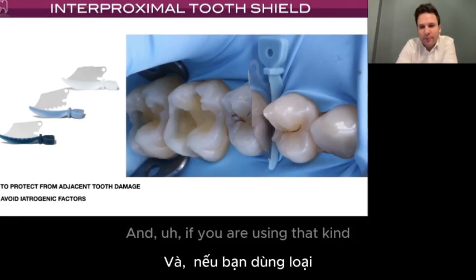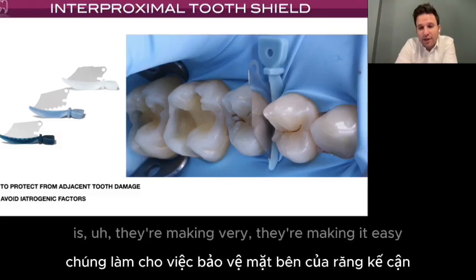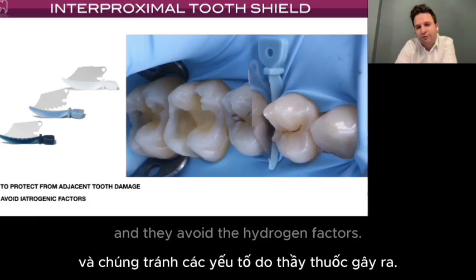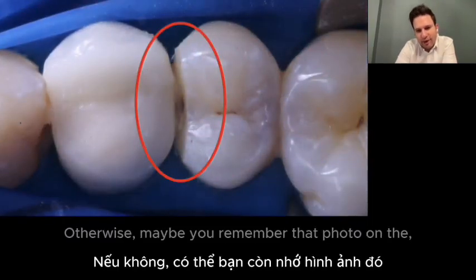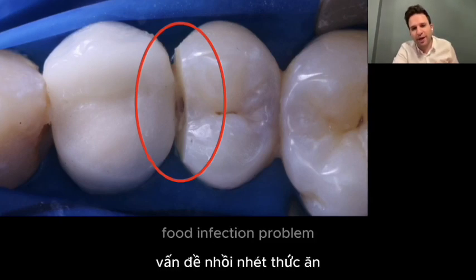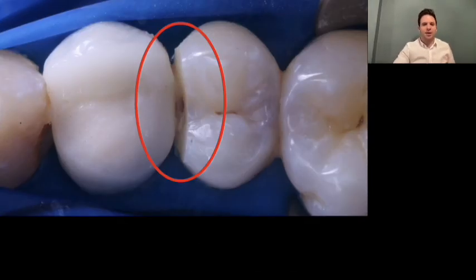And if you are using that kind of interproximal matrix system, it makes it easy to protect the proximal side of the adjacent tooth from damage, and it avoids iatrogenic factors. Otherwise, maybe you remember that photo from the first session, that patient had a food impaction problem, and the main reason was iatrogenic factors.